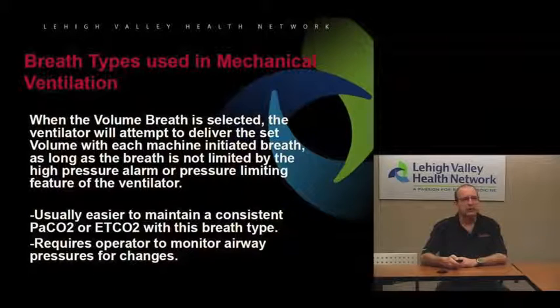When we're using the volume ventilation, it's usually easier to maintain the same CO2 levels, whether you're getting them by blood gas or from your capnography. And when you're doing this, you have to remember to monitor your airway pressures for any changes, which means there might be some changes with your patient.